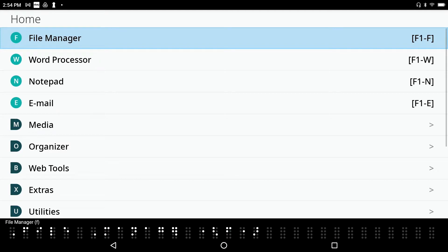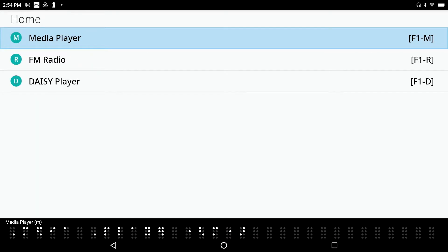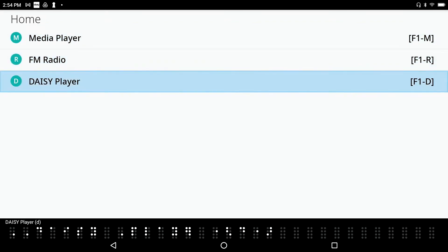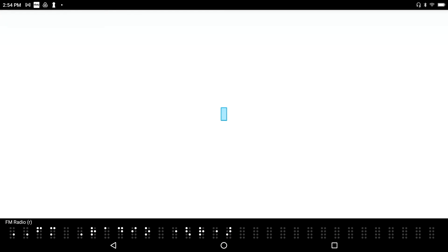File Manager. I'm going to go ahead, now that I've pressed F1 to go to the main menu, I hear that File Manager is selected, and I know that M is the hotkey or shortcut key that's going to get me into the media folder. Media Player. In here we've got a Media Player. FM Radio. FM Radio. Daisy Player. And a Daisy Player. Let's go into the FM Radio.